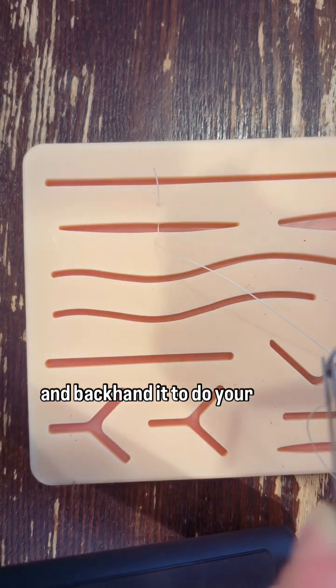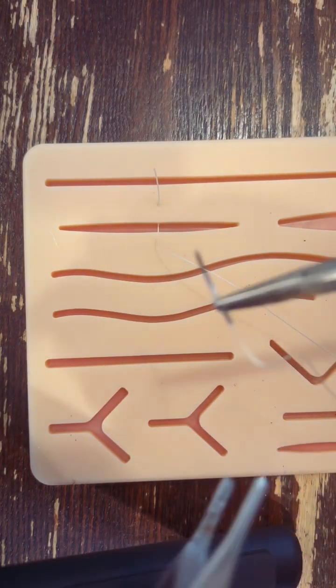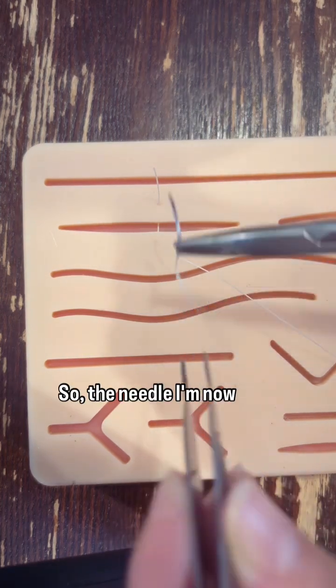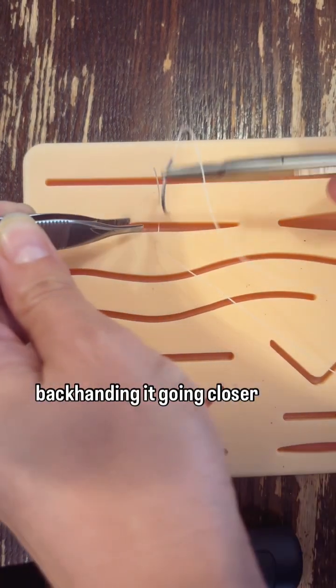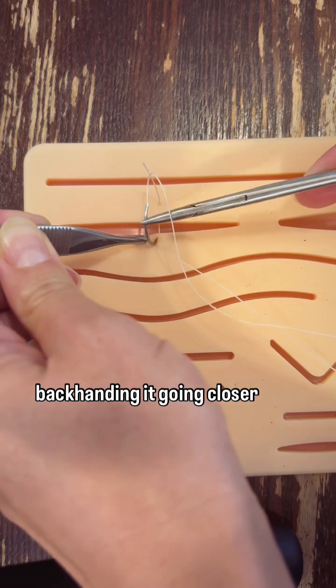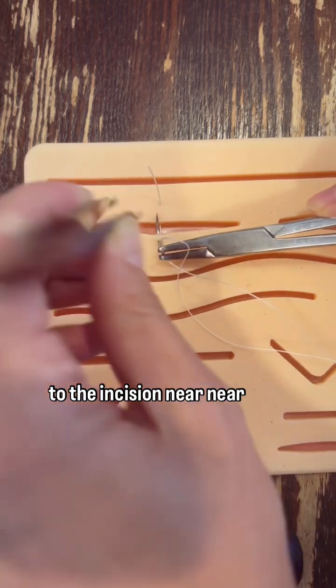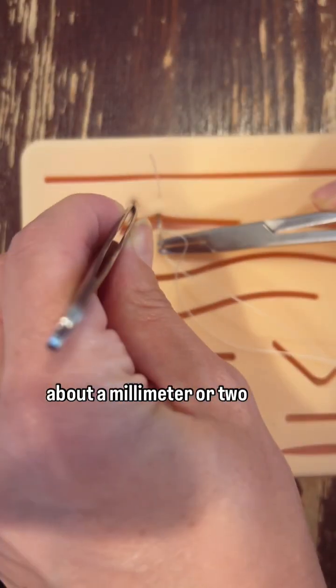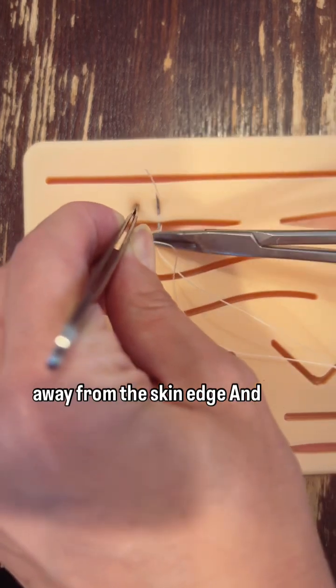I'm now backhanding the needle, going closer to the incision. Near near, about a millimeter or two away from the skin edge.